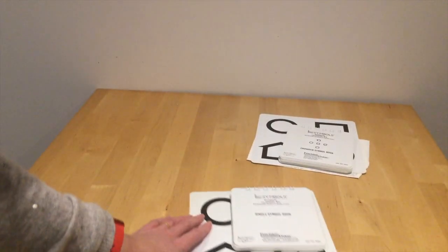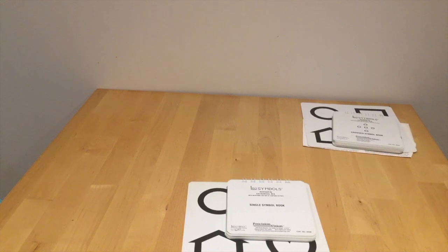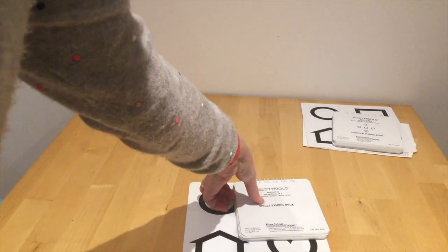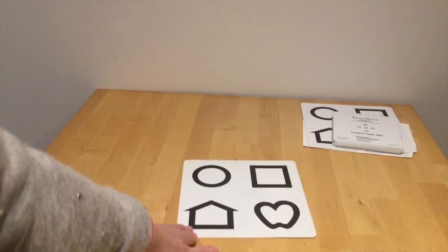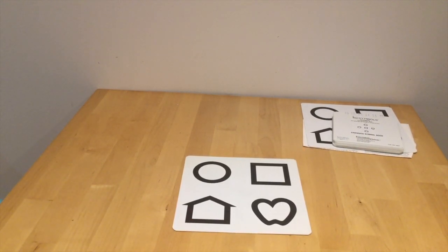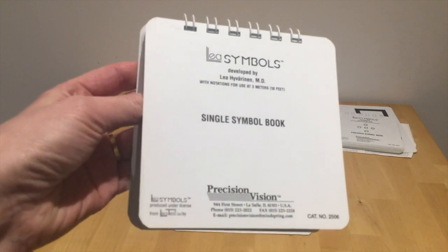So I'm going to bring this one forward. This is the single assessment book. Now, we have the key card if the child still needs that to match the shapes if they are not able to explain what they are. So here is the book. If I hold that up, it's a single symbol book. It gives a bit of information.